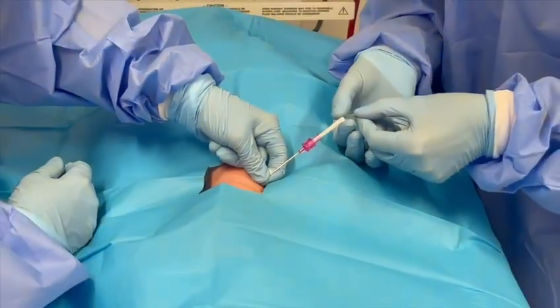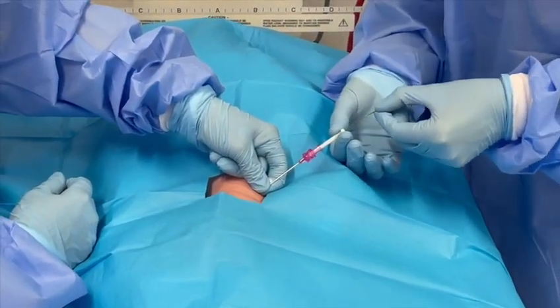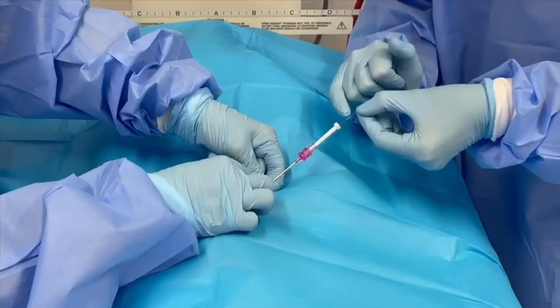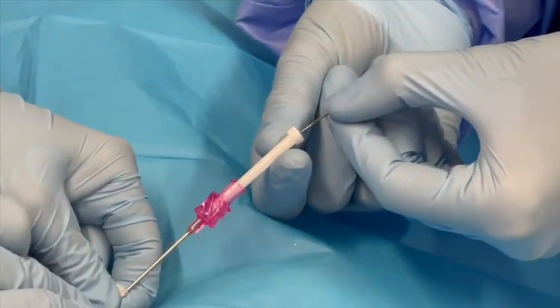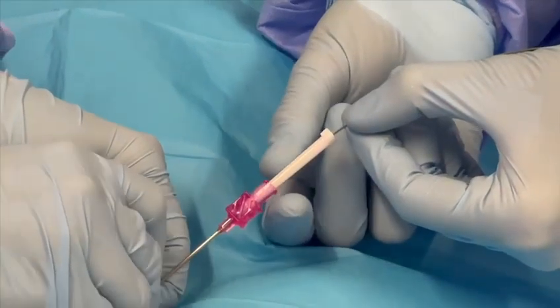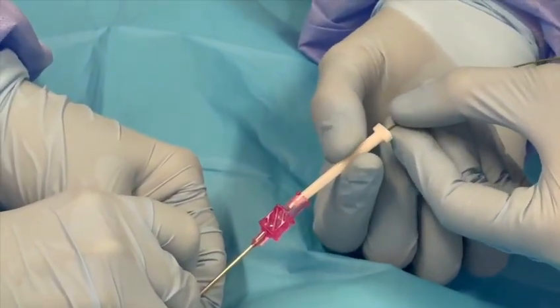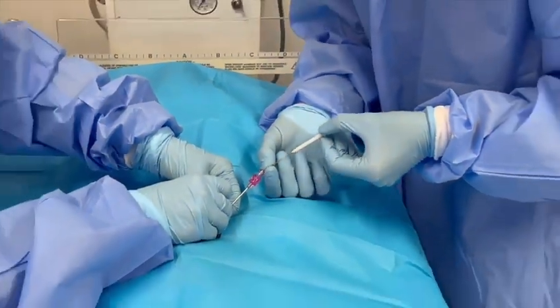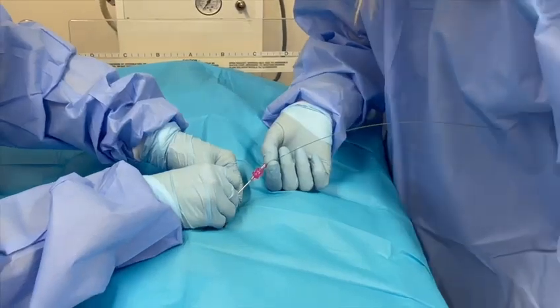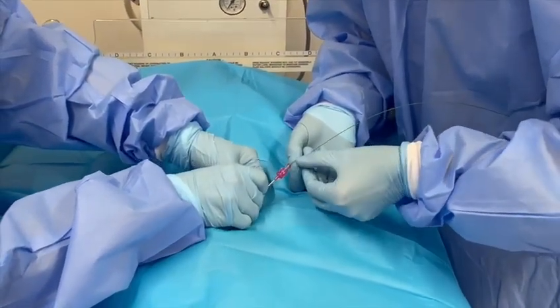Advance until the silver guideline on the wire reaches the white plastic tip. Remove the white plastic tip prior to removing the needle while not allowing the wire to move.